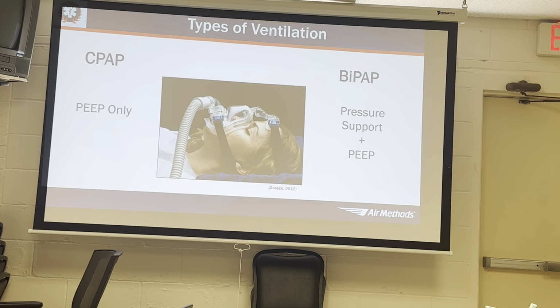It's because that machine is constantly sensing that they're taking a breath, they're taking a breath, they're taking a breath, so it's continuously giving that high pressure. So getting your patients to just slow their breathing, exhale, inhale.